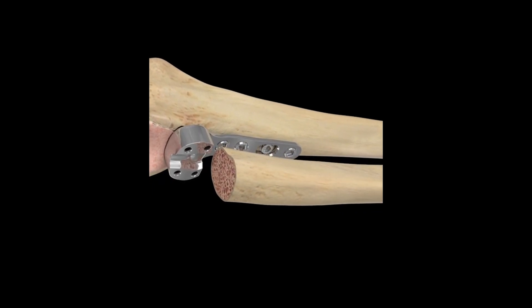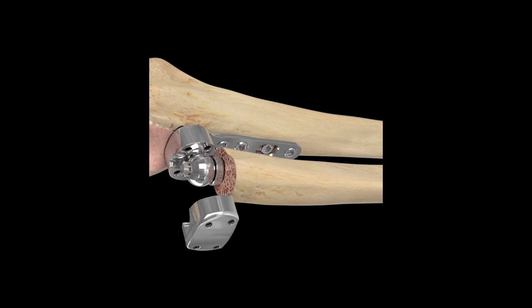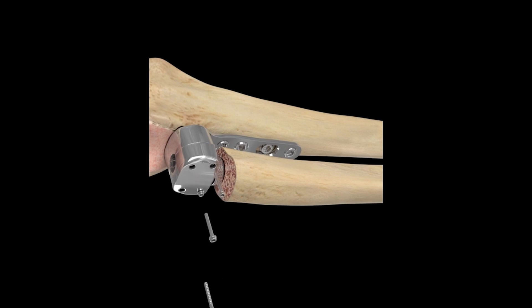A reamer is then inserted down the ulna to create a hollow canal into which the ulnar prosthesis is inserted. A polyethylene ball will be placed over the ulnar prosthesis, which sits in the radial plate.